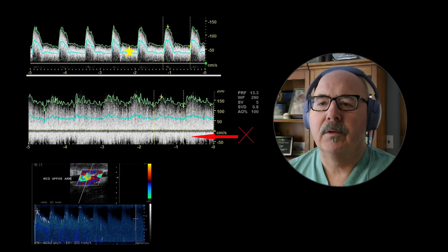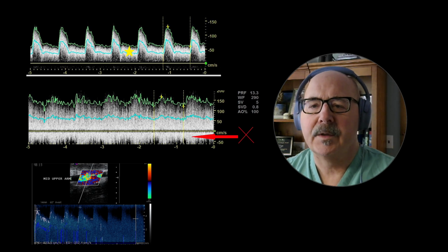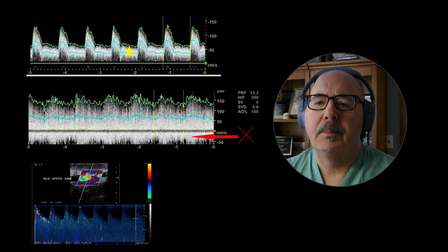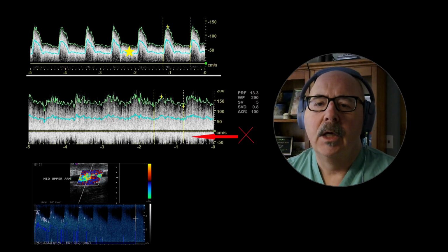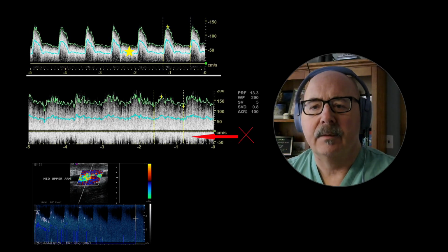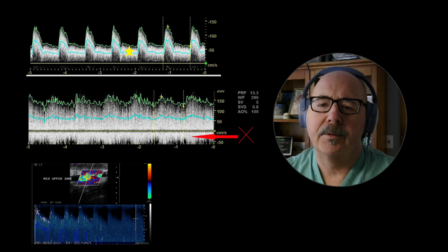When measuring the volume flow on the venous side of the fistula, where the velocities tend to be very high and flow is chaotic, it's important to find a good location. Chaotic flow will appear below the Doppler baseline and skew the mean velocity value. You may need to find a site downstream, that is to say more central, where velocities decrease and flow becomes more organized. Avoid a tortuosity or other flow disruptor.